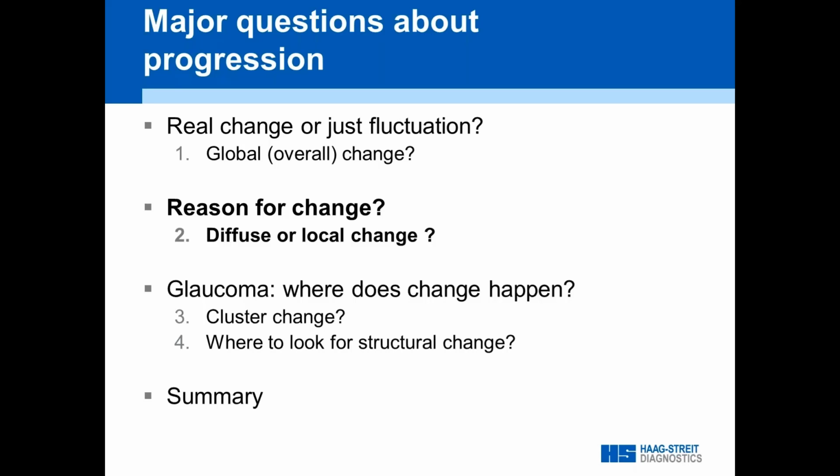Okay, so obviously statistics are never 100% perfect, but a filled arrow means that out of 100 field series with zero change, it makes one mistake, assuming something to be progressing where it's actually not. So this is a very strong message. And the unfilled is just a little bit of a weaker message.